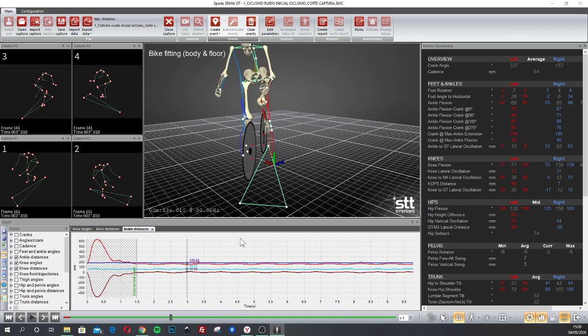Okay? But if we are doing nothing but this vertical limit event, our numerics are totally clean and our report, if we generate it, is totally clean. This won't be affected. But the capture, every time we open it, already has this corrupted part. So how to trim that?